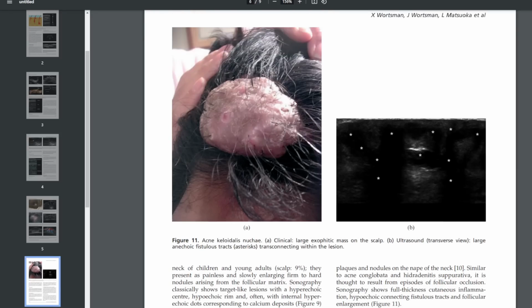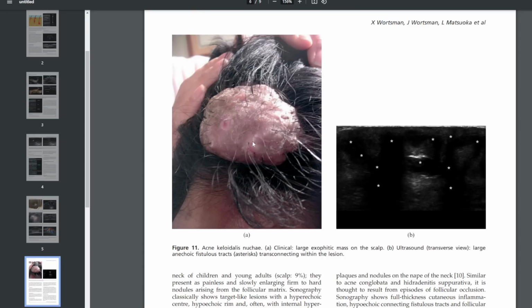But AKN, a lot of people typically get this from dirty razors, just a really, really bad scalp infection where you get these weird nodules and pustules. It just is awful. However, I don't think you need to use ultrasound technology to see this, but this is an interesting demonstration.